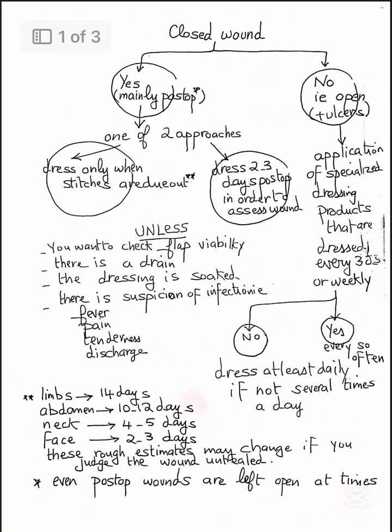Care during removal is critical to prevent infection or tissue damage. When to remove a drain typically depends on output volume and characteristics, indicating whether healing is progressing or not.